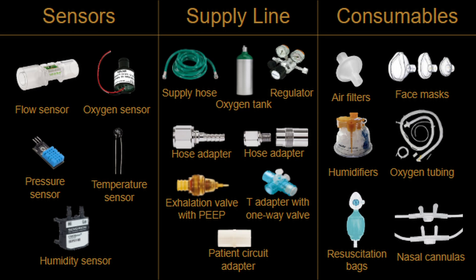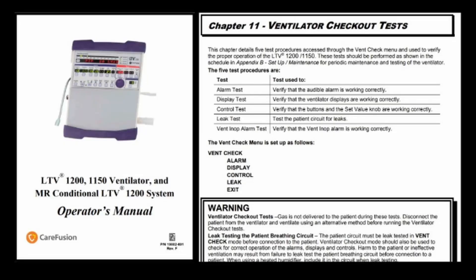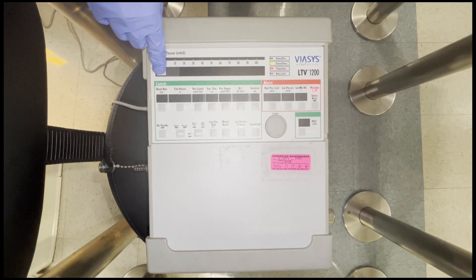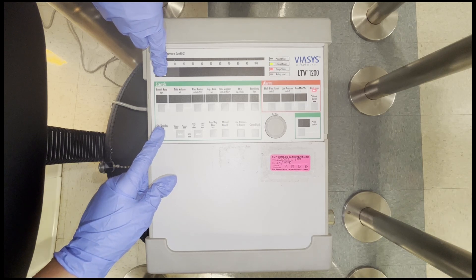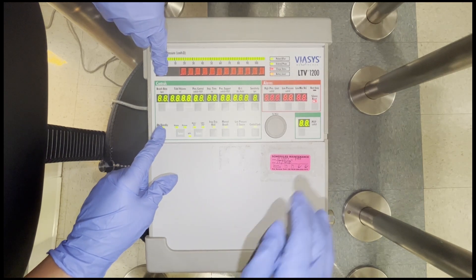Consumables are parts that should be replaced for each patient. They include self-inflating bags, filters, and the patient circuit. Most ventilator units have several built-in self-tests for easy testing. In this video, we will outline the self-tests of the CareFusion LTV 1200 model; other models should have similar processes. Look for a section about testing or maintenance in your manual. On the LTV 1200, the special menu is accessed by holding select while turning the ventilator on.